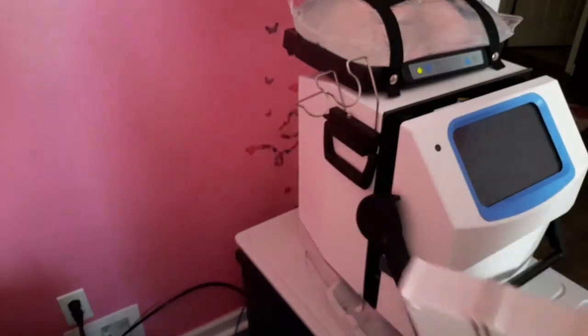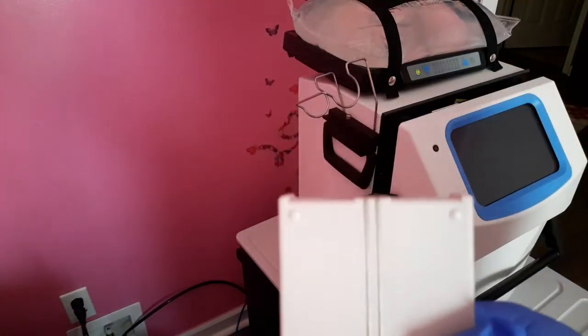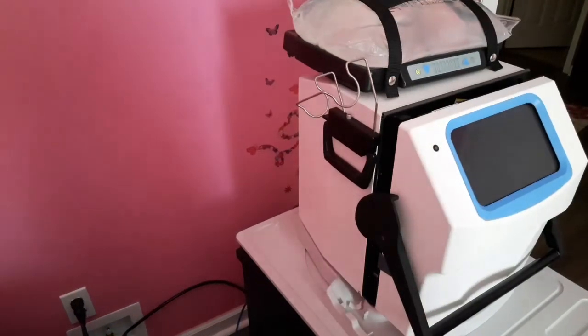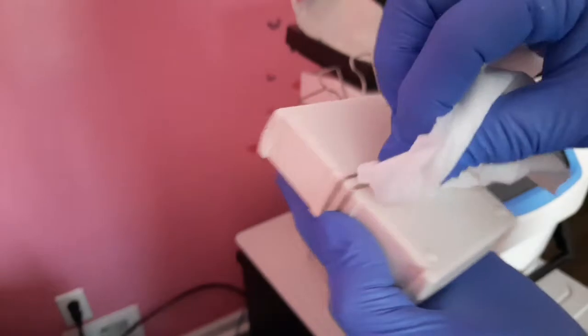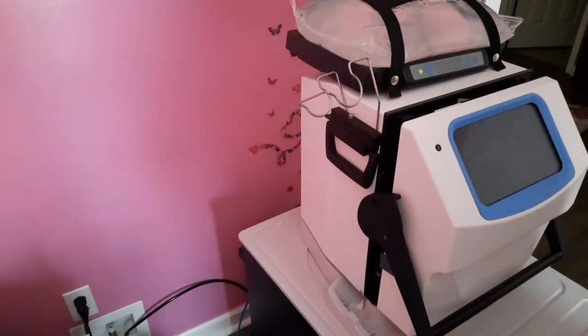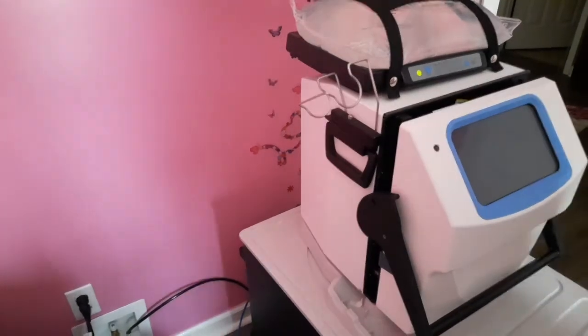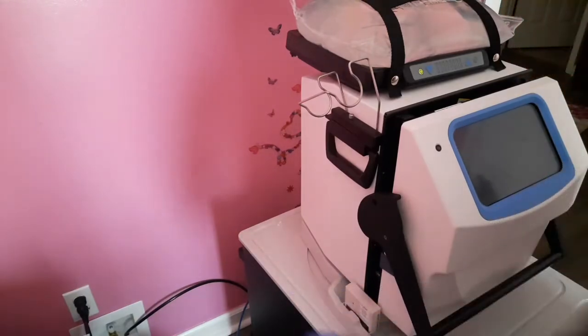So what I like to do is take a wipe and just pass it along the two sensitive metal bars there to make sure that it's working. So I'll be right back. Okay, I've got my sanitized wipe, and here's the two bars, and it's very loud. So now that I've tested that, I'm going to go ahead and sit it right back where it belongs, so I can go to work as soon as I get this cartridge in.